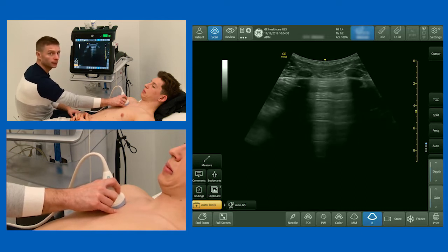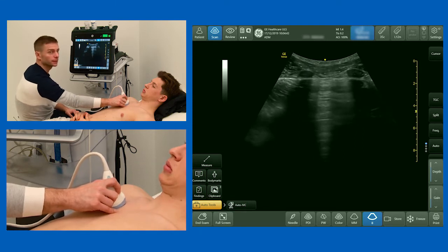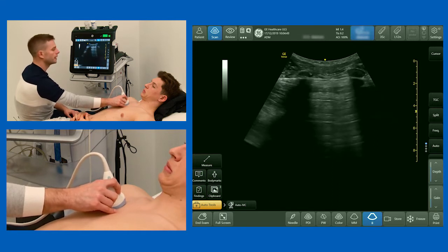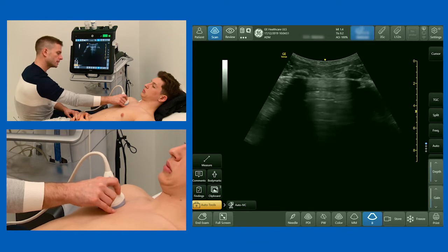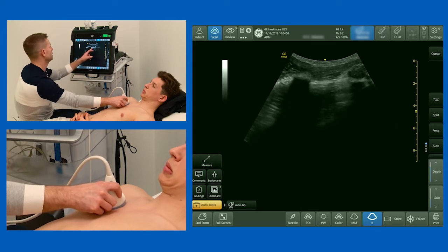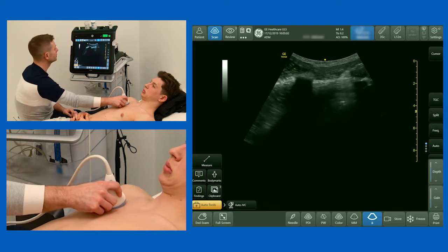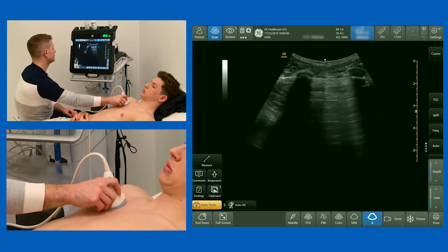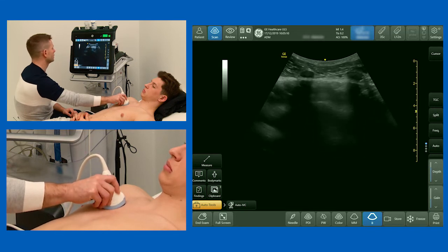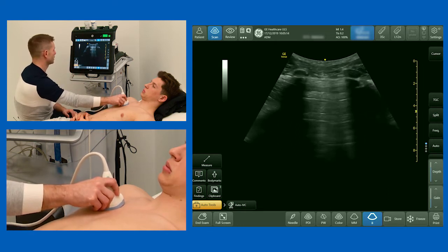You will see A-lines in normal lung and also in a pneumothorax. What distinguishes the two is that in a pneumothorax there'll be no lung sliding, whereas in normal lung there will be lung sliding. Note the position of the probe here, which is very perpendicular to the chest. If I angle the probe off to one side, the A-lines disappear. So to see A-lines, you need to be directly 90 degrees to the pleura.